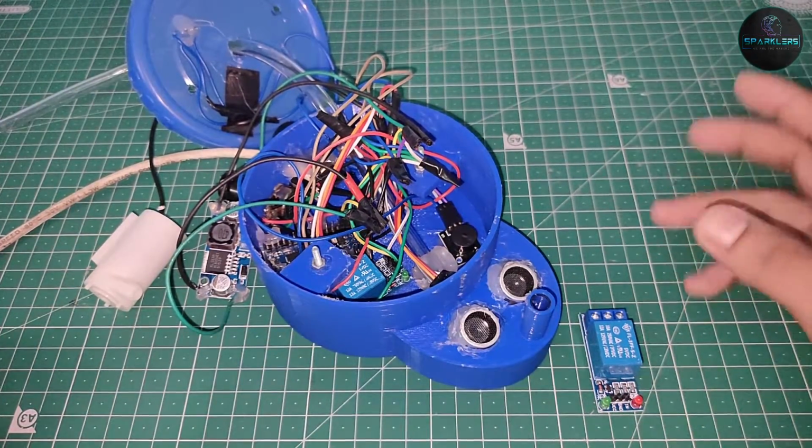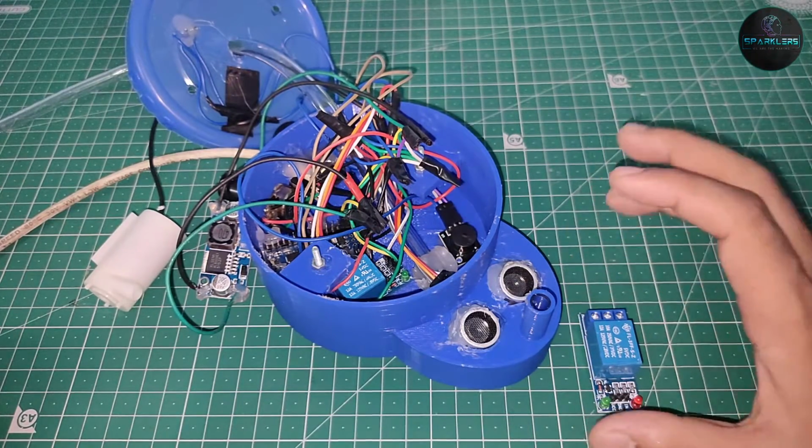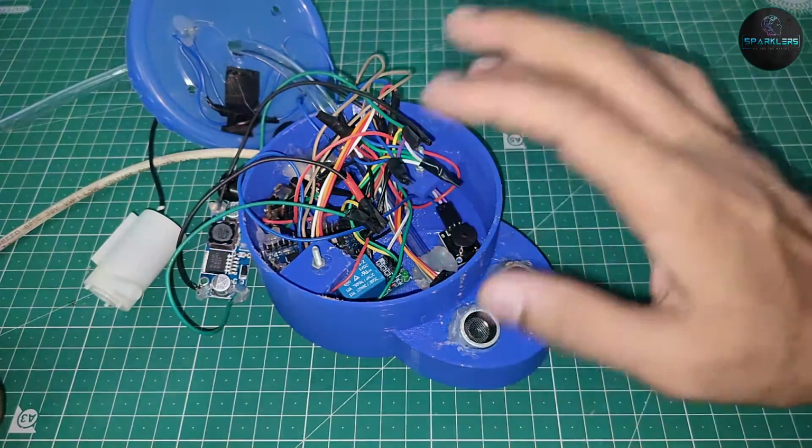Maybe some pumps work with Arduino directly, if the required current is less, but I recommend using a relay in this case. Now this is how you connect a relay.